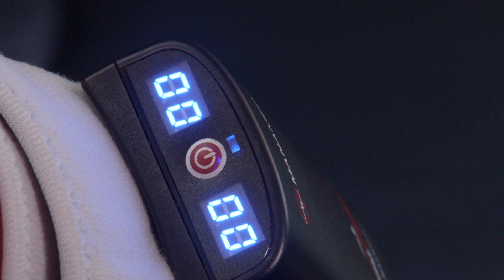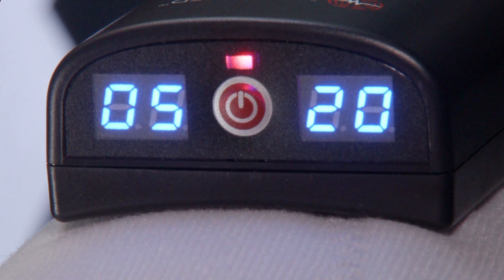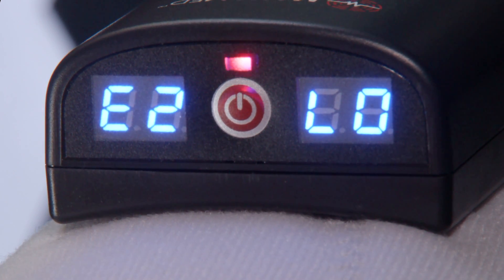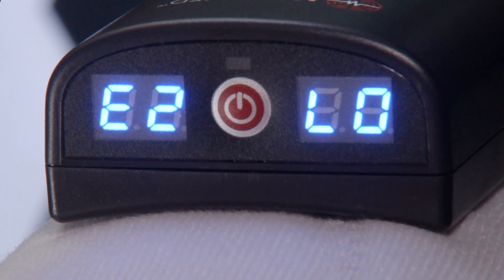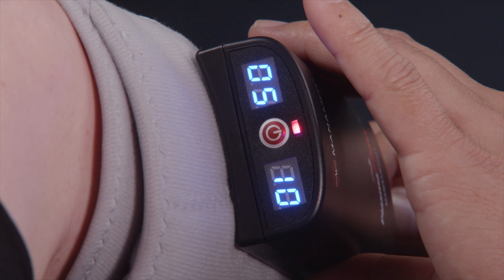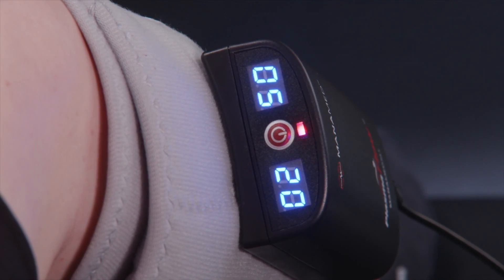When the units are not in use, the accumulated time is saved until the unit is turned on again. When the battery is low, you will hear a beeping and see an E2 on the left display and an LO on the right display. A red light will flash indicating the unit needs to be connected to the power supply. The power supply can be connected to the unit while still in use and on the patient. Once connected, a blue and red light will flash.